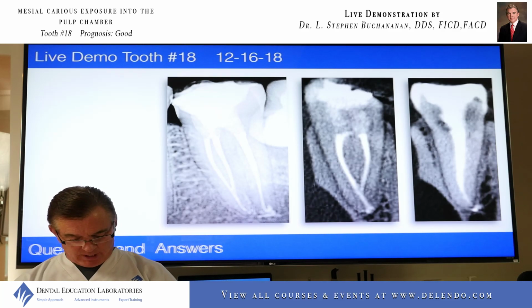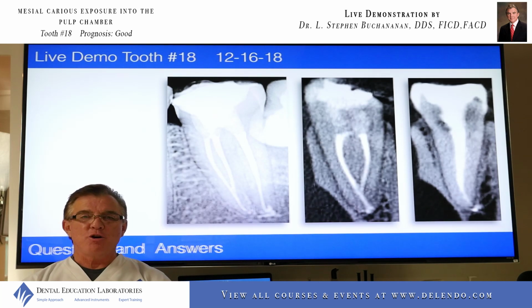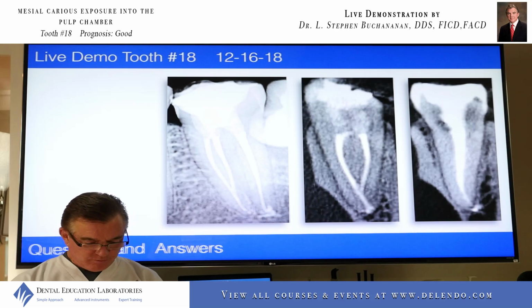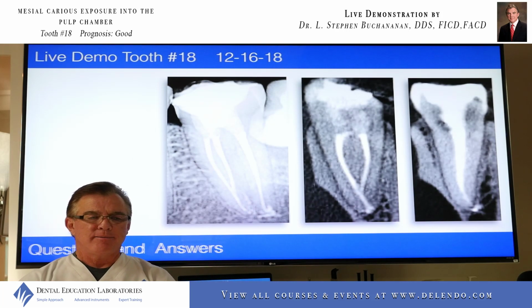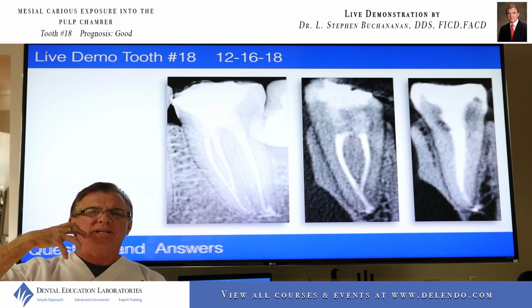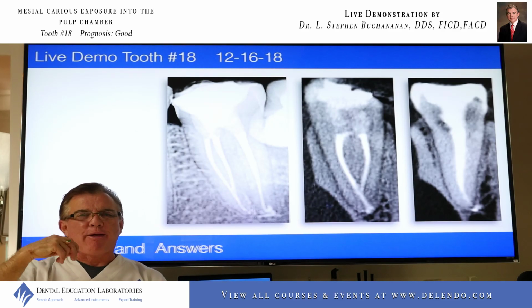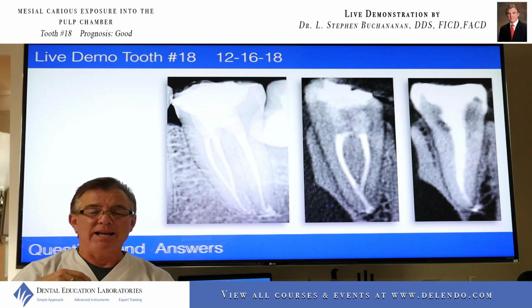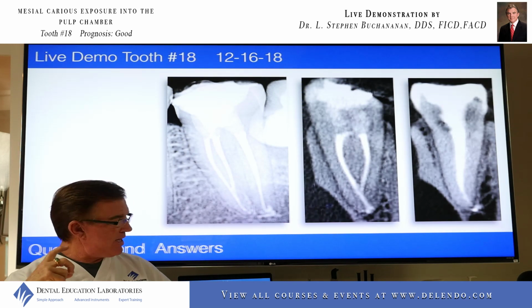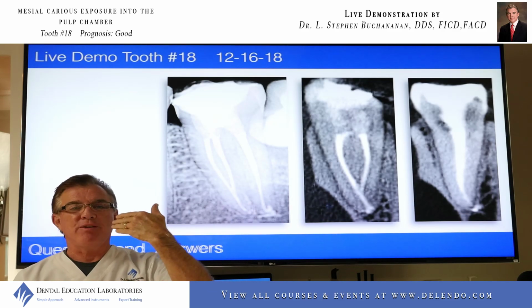Okay. Last question. What's the portable handheld x-ray device? That is a Nomad x-ray device. They are fantastic. The worst part of taking working films is trying to get those unwieldy sensor holders to work around rubber dam frames and rubber dam clamps. What I've evolved to is using a rubber dam frame that has a hinge at the top and bottom. You just hinge it open, you have perfect access in there.